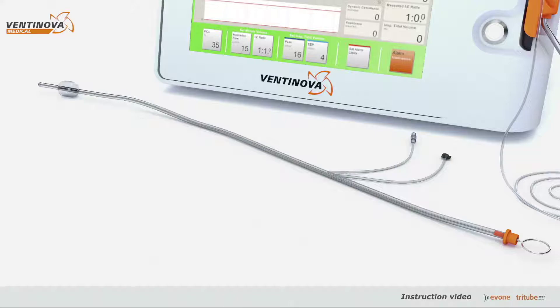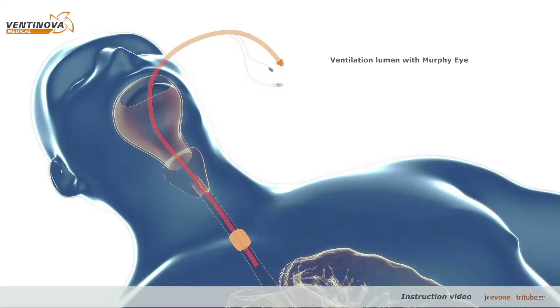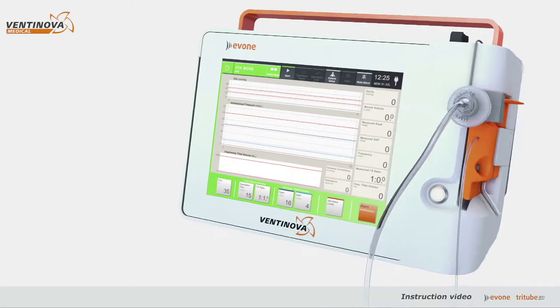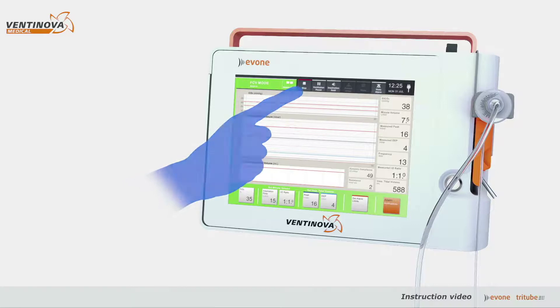Tri-tube is an ultra-thin 3-lumen ventilation tube with a ventilation lumen with Murphy eye, a pressure lumen for continuous intratracheal pressure monitoring, and a cuff lumen to inflate the cuff. Ventilation is started by tapping the start button on the screen.